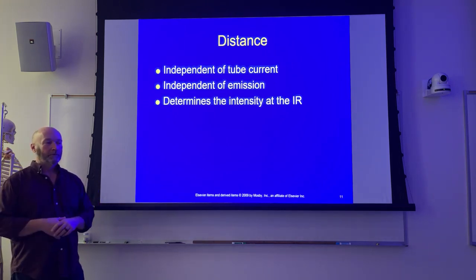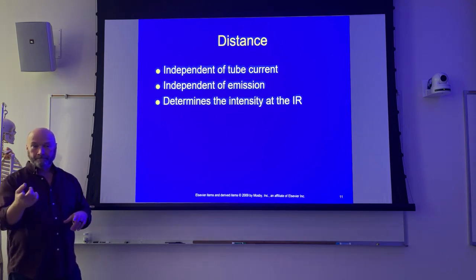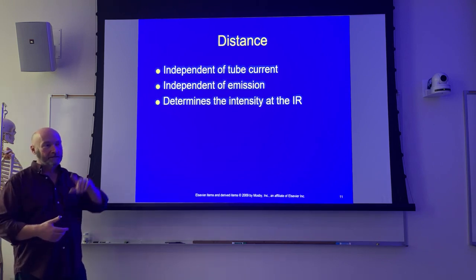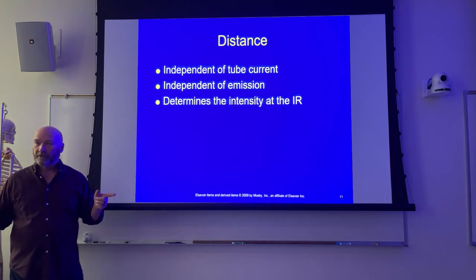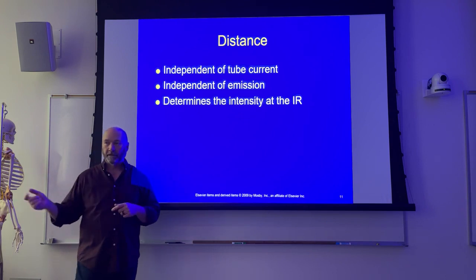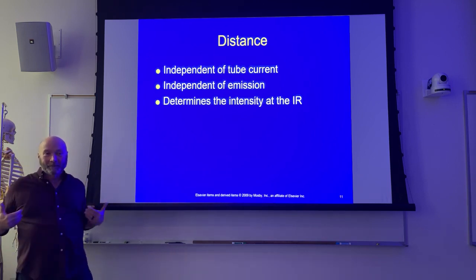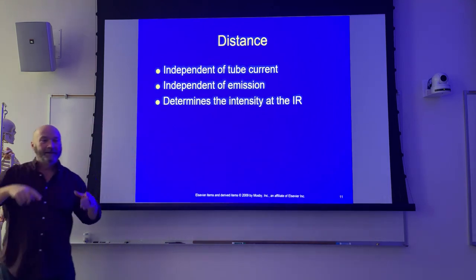How do your AECs work? What do they do? Penetration, remnant beam. The remnant beam, it picks up the signal in the remnant beam, it counts the photons, and it sends a signal over to the timer circuit to discontinue the exposure, right? So if you back up to 72 inches, if you set your technique, from 40 inches to 72 inches, what do you have to do? Okay, you're getting ahead of me. I backed up a little bit because I wasn't getting any kind of feedback here. But yes, I'll get there in a second.